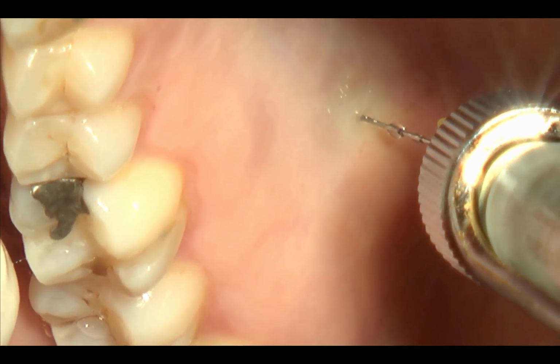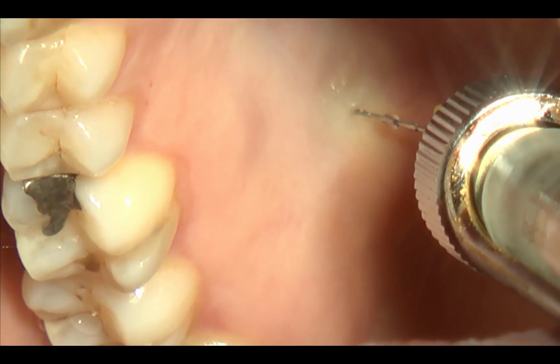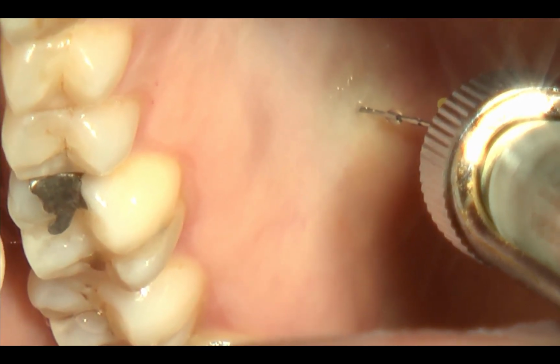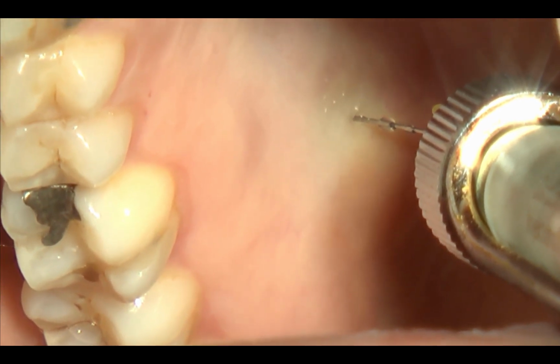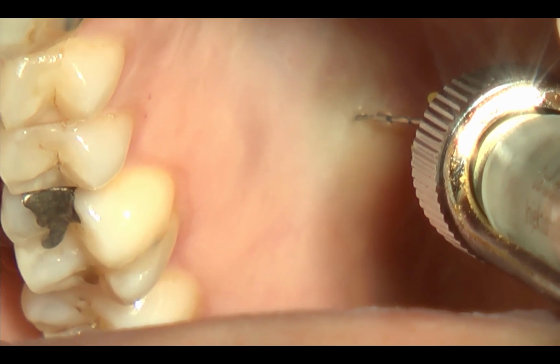You don't have to make the full anesthesia now, just some anesthesia that will be reinforced at the time of the harvesting procedure, but at that time the patient will not feel anything more because anesthesia has already been done.